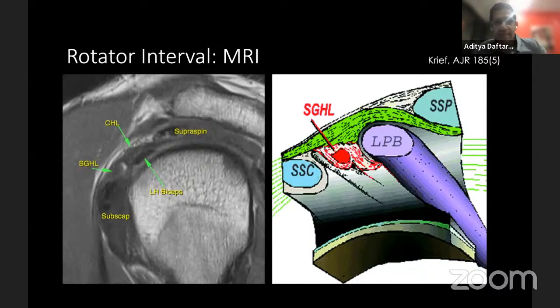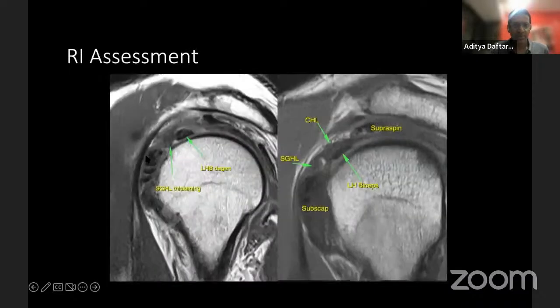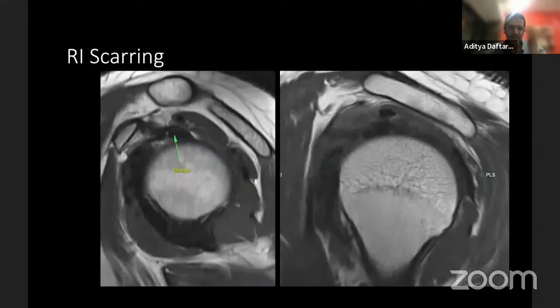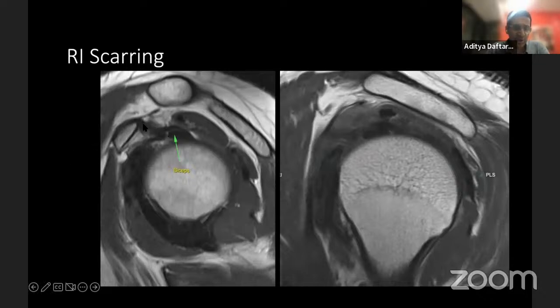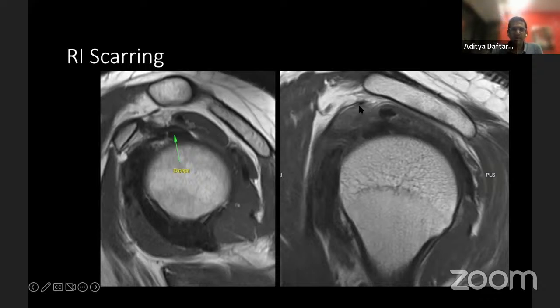Moving to the rotator interval: here is somebody with a normal rotator interval showing the ligamentous structures, and here it's much thickened in somebody with adhesive capsulitis. A normal biceps with the coracoid process tip, coracohumeral ligament, and superior glenohumeral ligament is shown. In adhesive capsulitis, there's extensive edema and thickening in the rotator interval area — you can see the fat very nicely in normal, whereas in pathology you see edema, blobbiness, and soft tissue scarring.